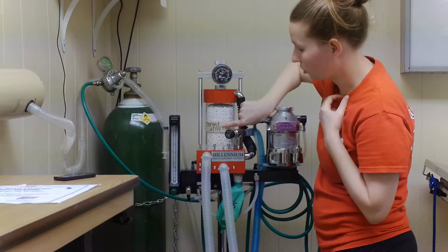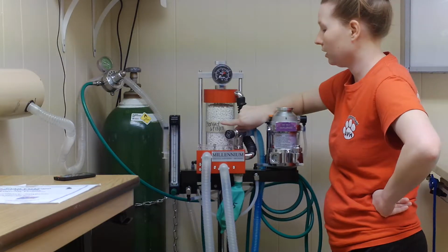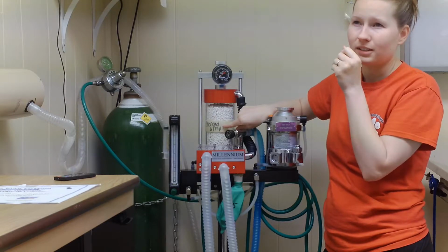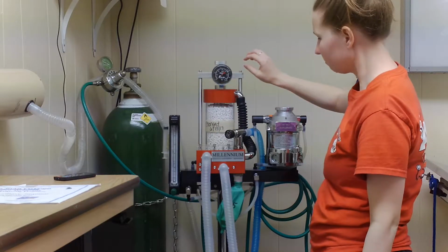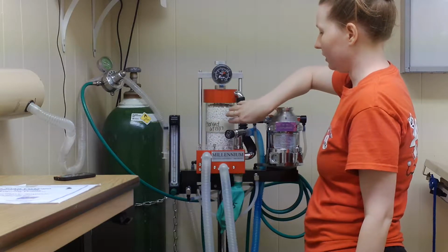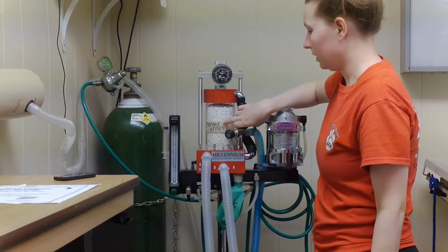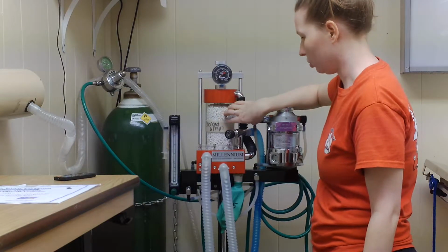And you can see that this was changed on the 13th. We haven't had too many surgeries since the 13th, but typically you want to change it every 2 or 3 days, because roughly about 8 hours worth of surgery is really all that this will handle, and it starts to turn purple. We can see that right now it is white, but that's just because it's not being used. It doesn't necessarily mean that it's still good. So that's why you always want to make sure that you have it stating what day it was last changed. So if you have any questions about it, always change it.